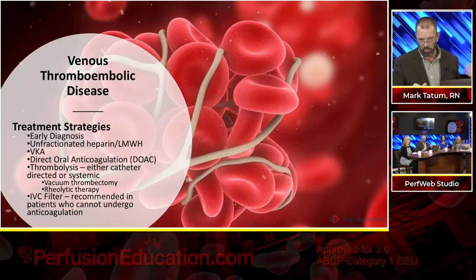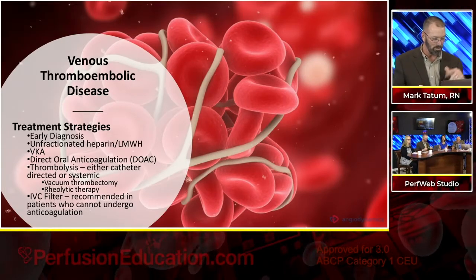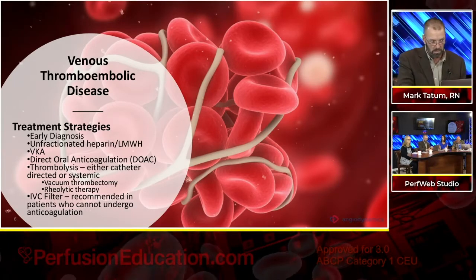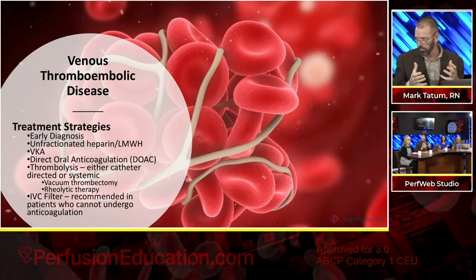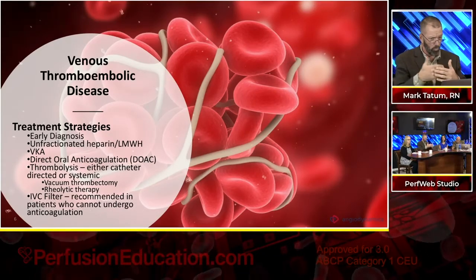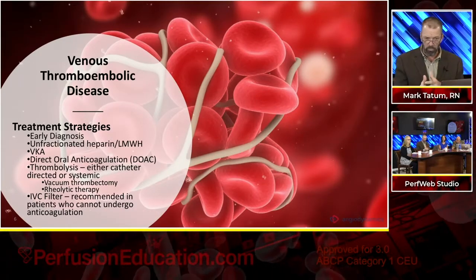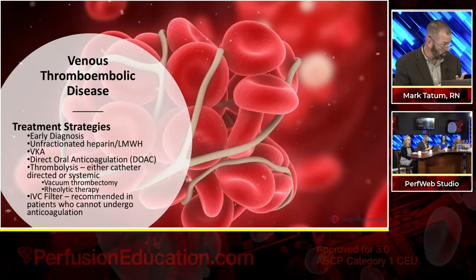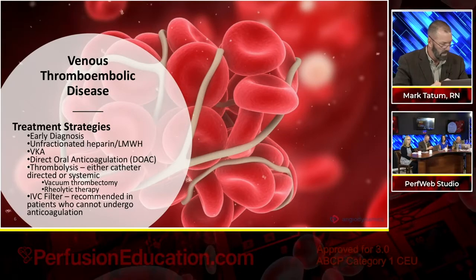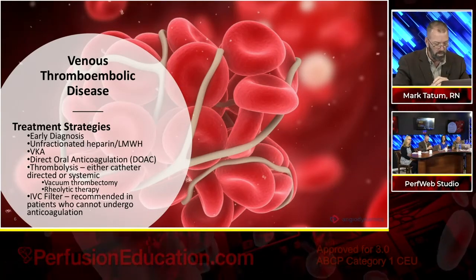So if somebody like Joe or myself comes in, where we've been abusing our bodies for more than 50 years, at least in my case, I'm not going to speak for Joe, we may not have as big of an effect on this, at least in the long-term sequelae. But in the short term, if you're looking for relief, we can provide that relief. In those patients that are younger, where you discover early on that they've presented with things like swelling and warm legs and redness, we have an opportunity to have a long-term changing effect by evacuating that thrombus before it has a chance to set in.